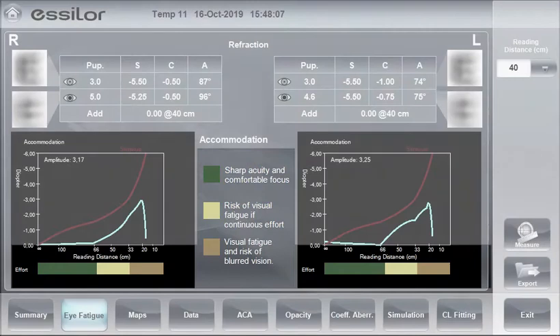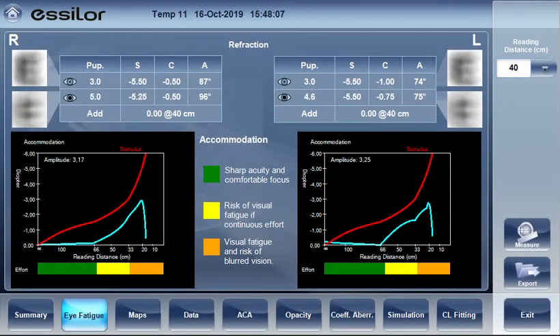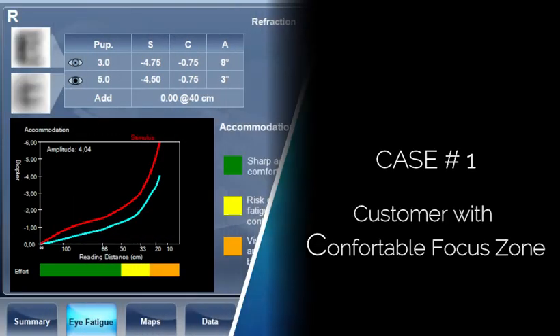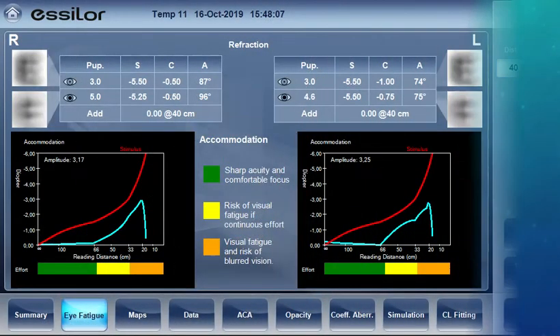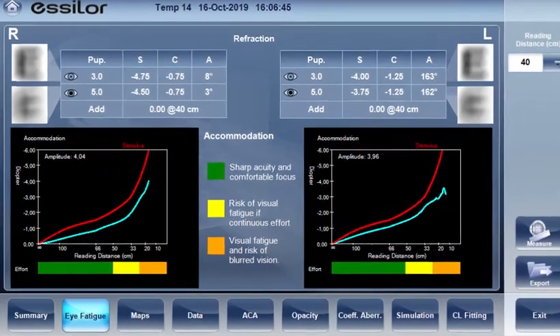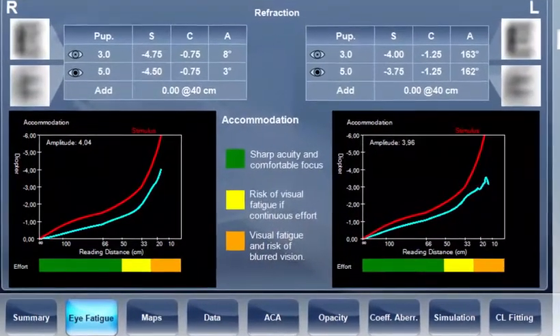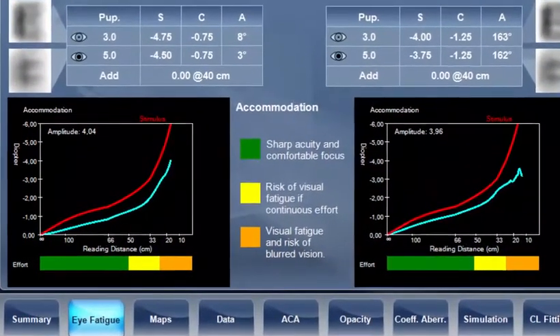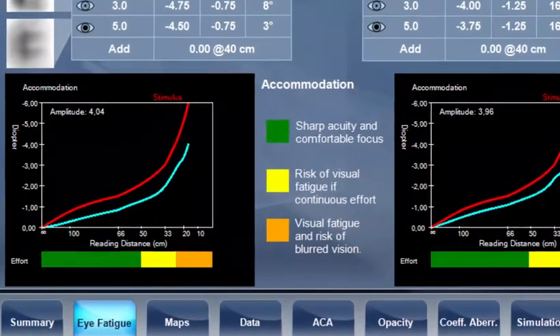Let's review three typical cases the eye care professional might face in everyday practice. Case one: patient with a comfortable focus zone. We notice a comfortable zone from far to intermediate distance — the green zone — then a risk of visual fatigue in near vision, and finally visual fatigue and risk of blurred vision under approximately 20 centimeters.